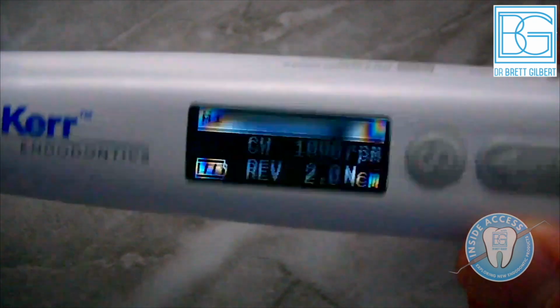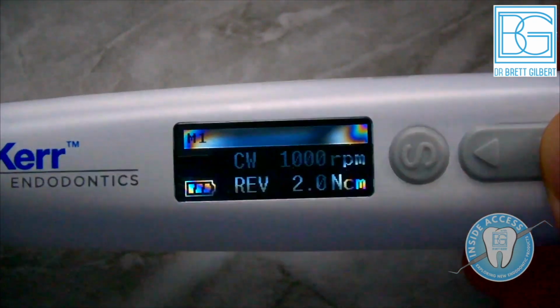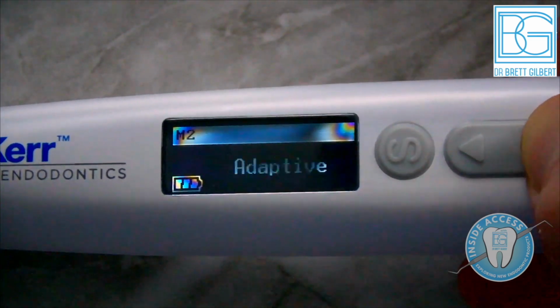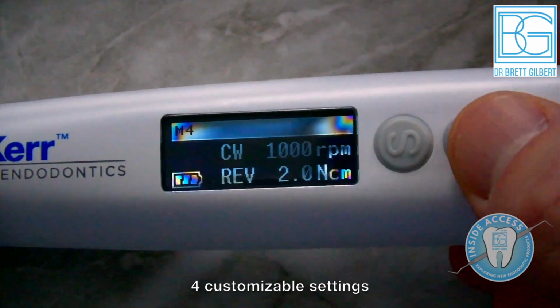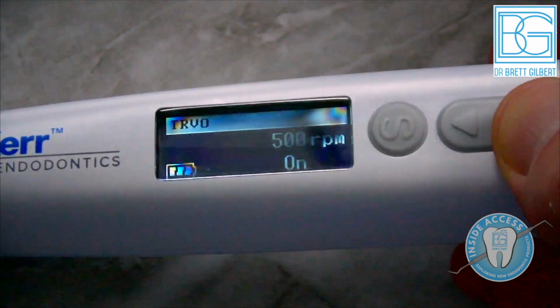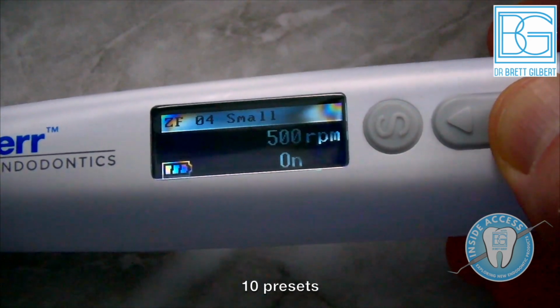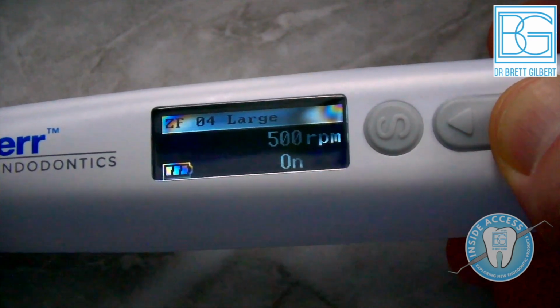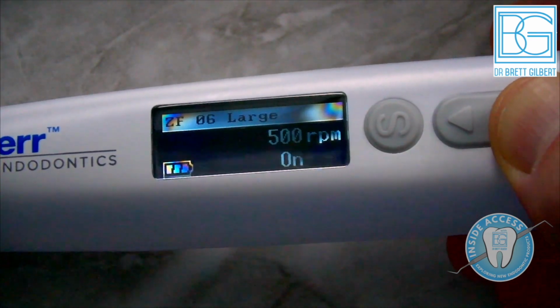Okay, so let's take a look at the display now in regards to the presets. So it has several different presets. This is going to be M1, it's got M2, M3. These can all be customized. Then you'll see it goes into the proprietary files. This is Traverse Orifice Opener, Traverse Glide Path. This is going to be Zenflex 04 Small, Zenflex 04 Large, Zenflex 06 Small, 06 Large.